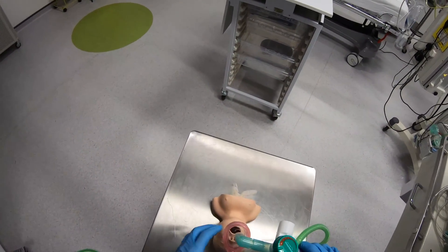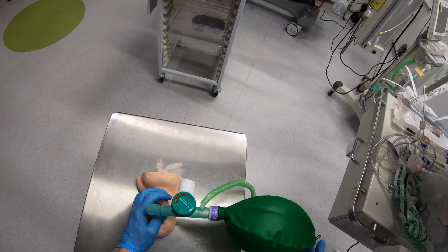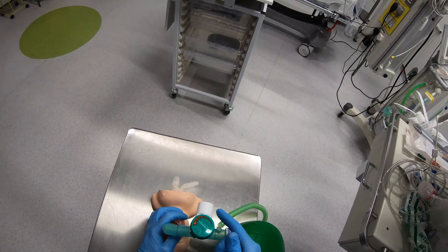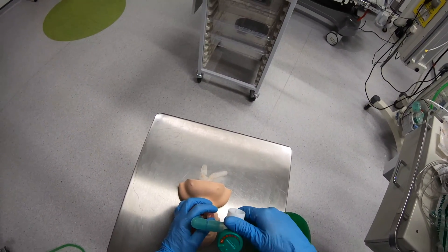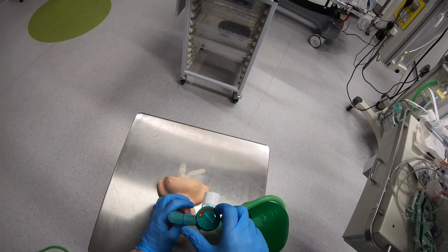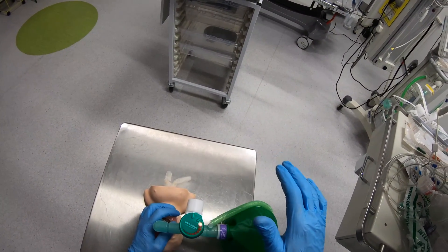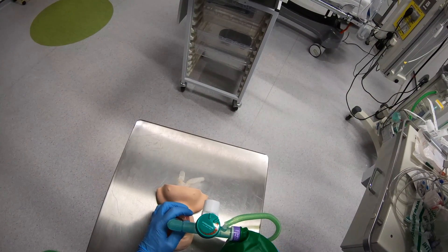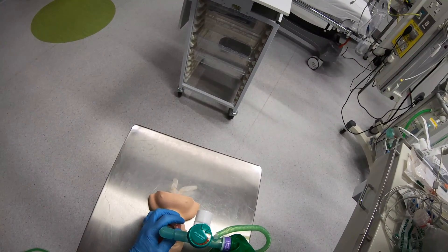You use it the same way as the Jackson-Reese modification of the Ayre's T-piece. There's no hole in the end of this bag — the hole in the circuit is over here. And you've got an adjustable pressure limiting valve on the top here. At the moment if I turn it anti-clockwise the valve is fully open, so if I squeeze the bag you hear that noise — that's most of the air blowing off out through this valve.